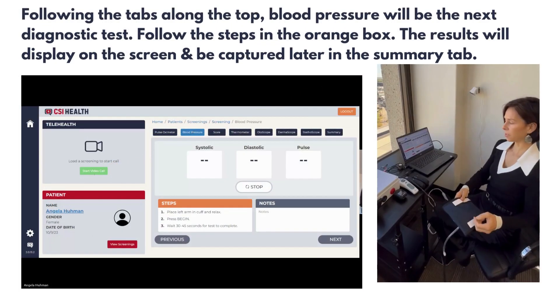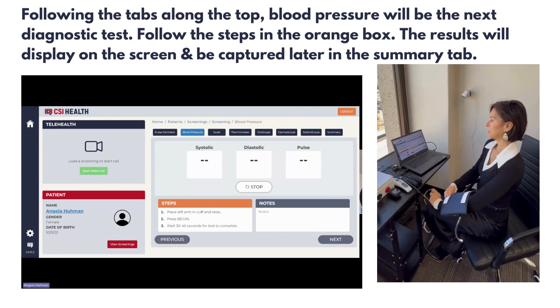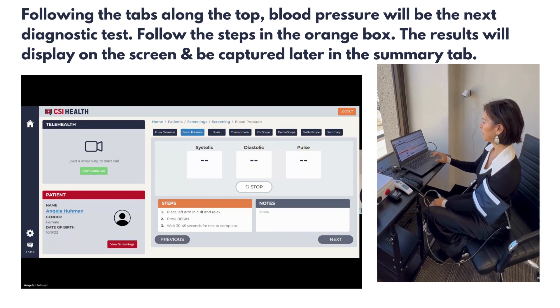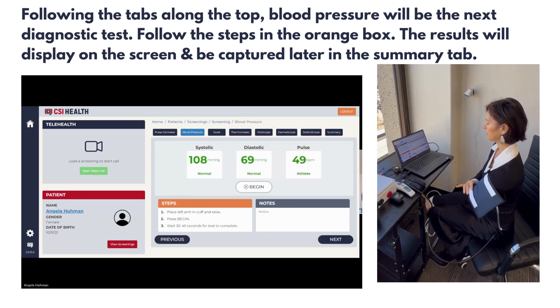If you choose to follow the screenings along the top of the tab, blood pressure will be next. The blood pressure results will be dynamically displayed on the screen.